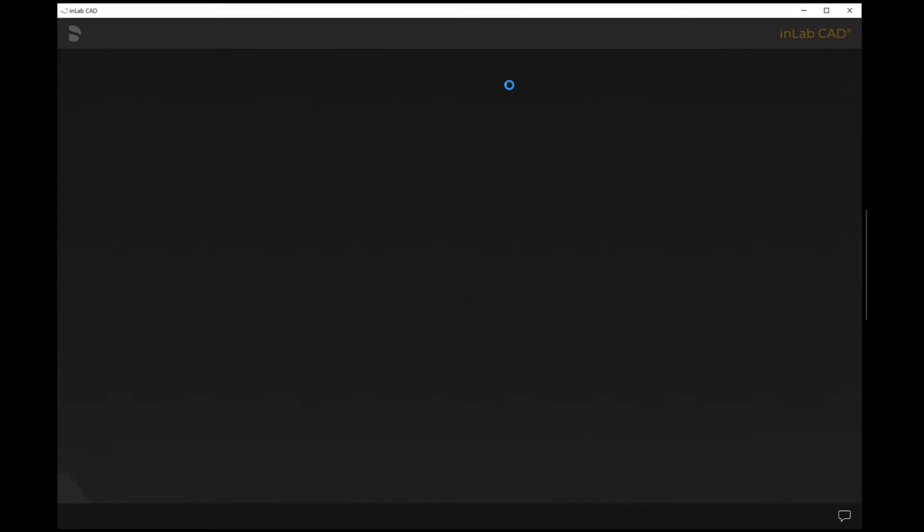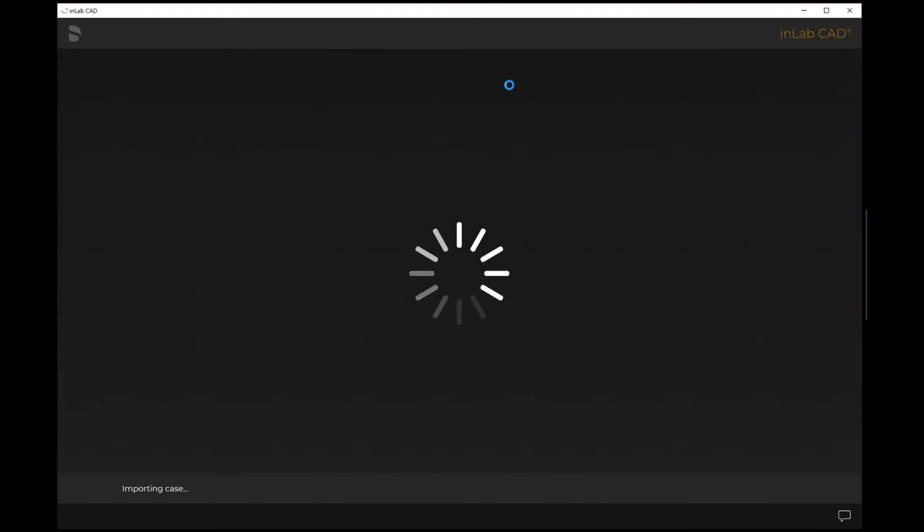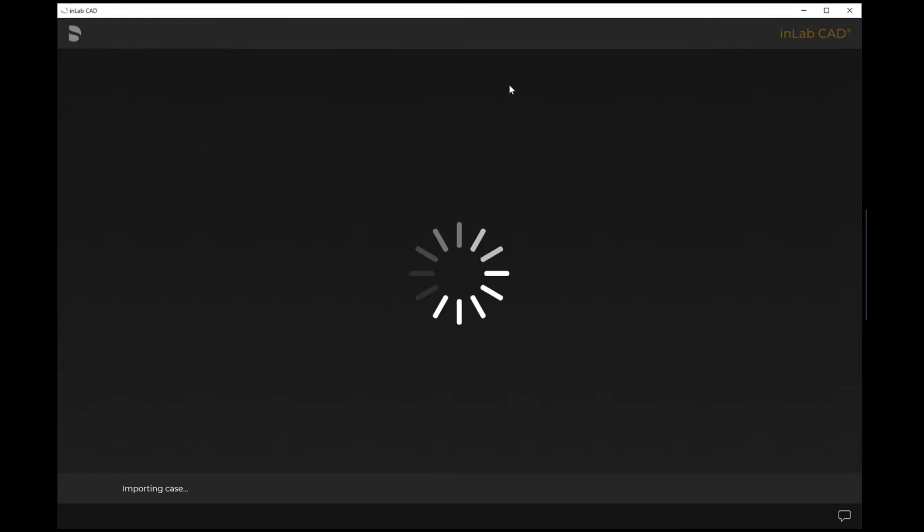That's how you're able to utilize the Connect Case Center portal within the inLab software to directly download your intraoral scans from your doctors utilizing a Dentsply Sirona intraoral scanner directly into the inLab software 22. Be sure to stay tuned for the other videos. Thank you so much for joining us today.